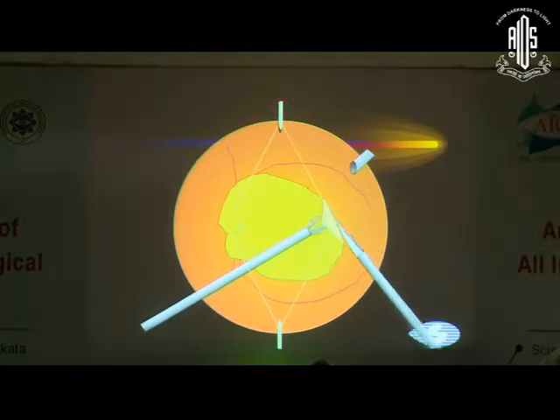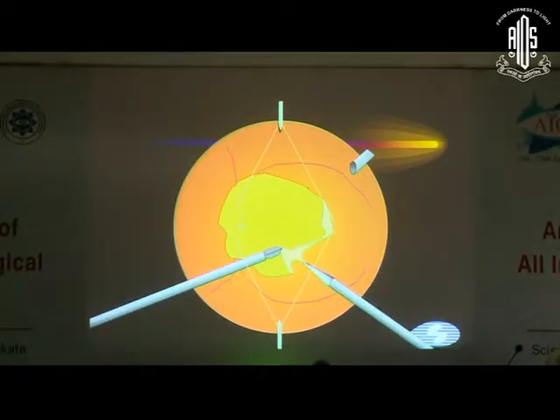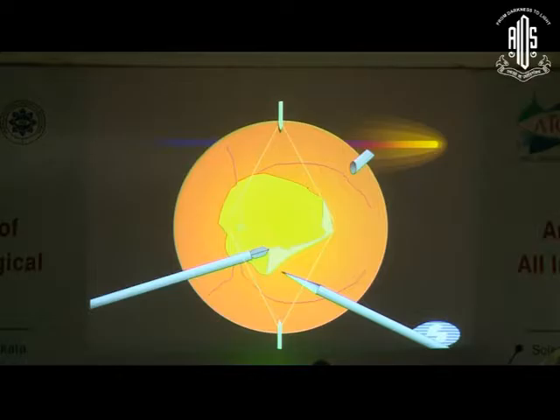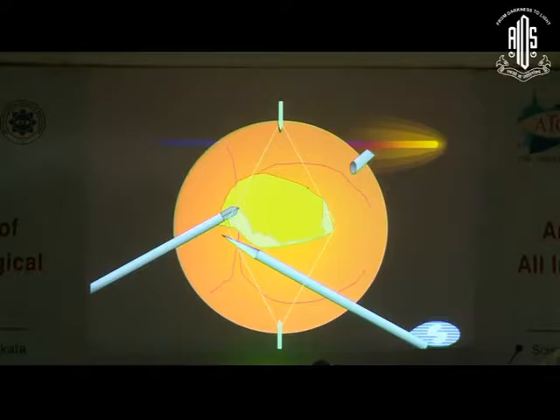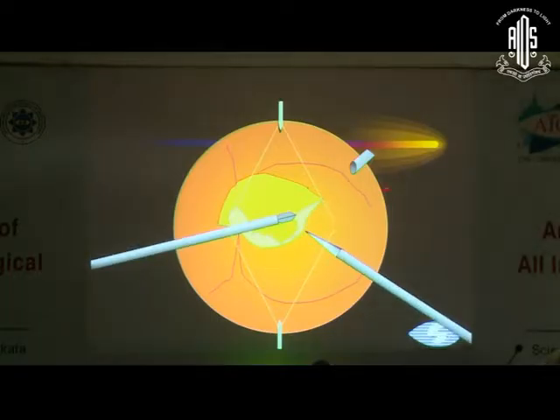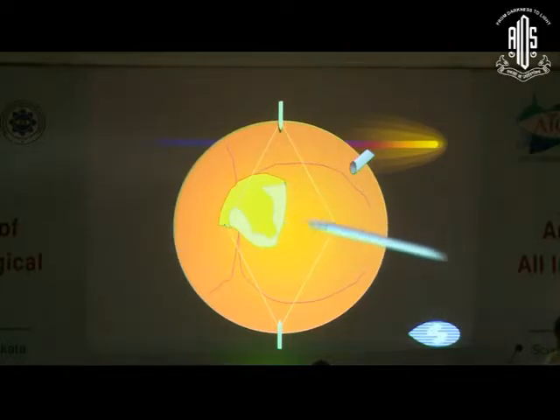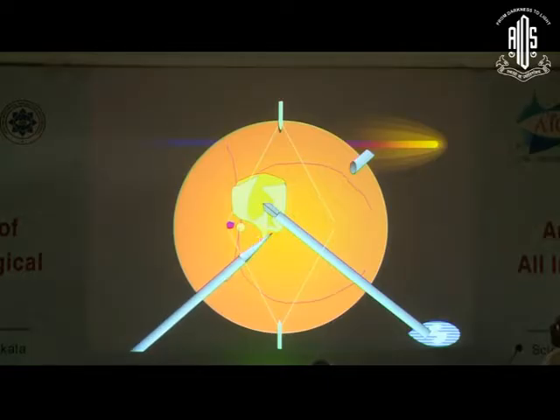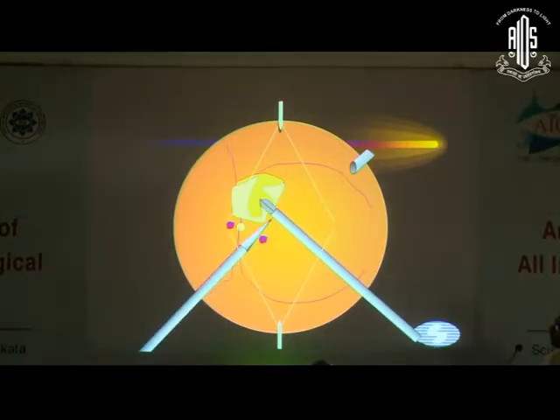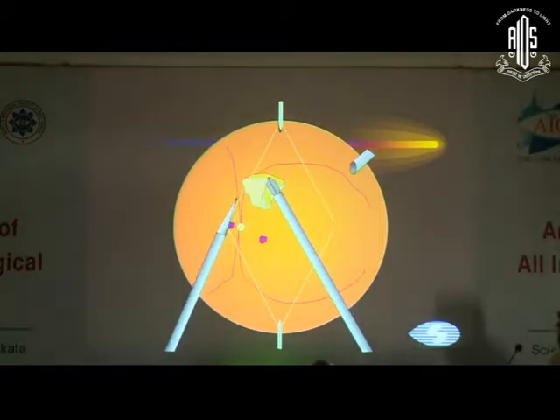You can use 2 chandelier lights for the bimanual, but nowadays with the torpedoes we used to use 2, but with the chandelier illumination now, which is really very good, often 1 light suffices. And what you are doing is actually using a combination of peeling, because where it's less adherent it tends to peel, and whenever you encounter an area of resistance or a broader area of vascular attachment, then you must cut that with the scissors. And with that you can remove this entire tissue.